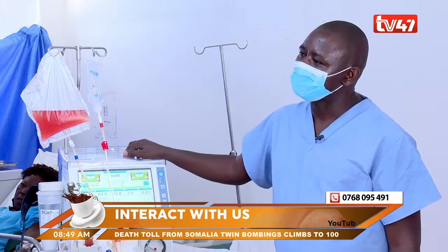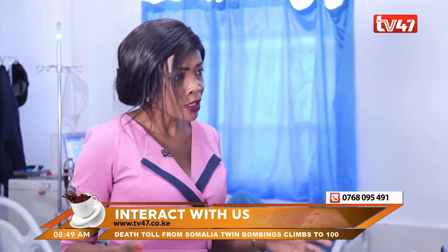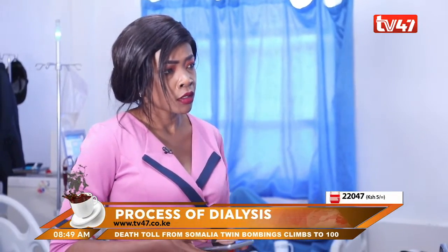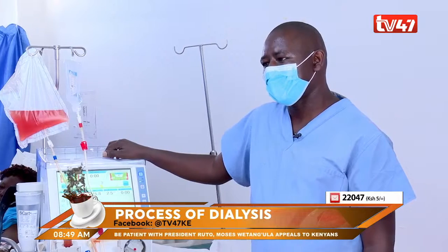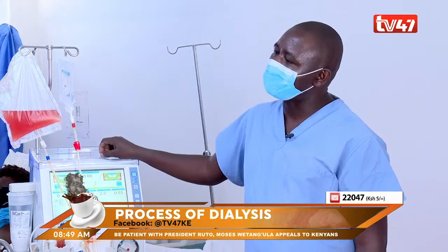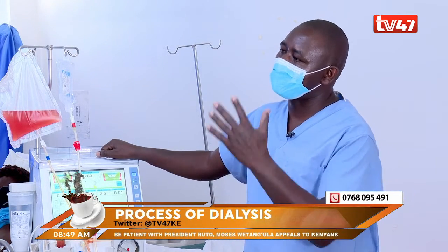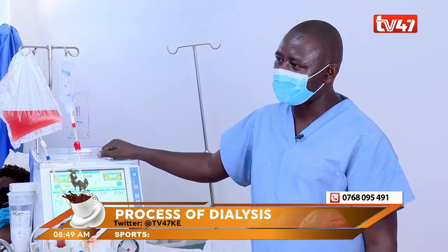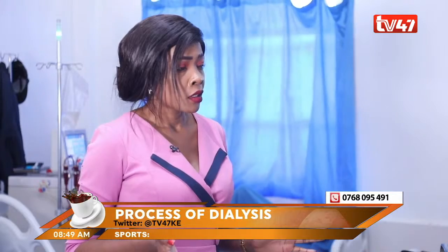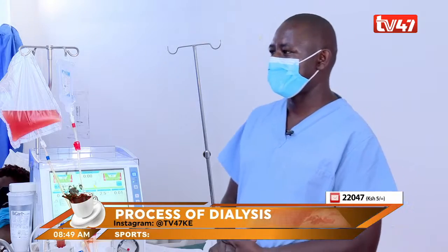You speak of different types of machines — does it mean there are different types of dialysis in terms of procedures? Majorly, this is normal dialysis. But we have a dialysis done for very sick patients who are in ICU — you can do dialysis even for 12 hours. This is called slow dialysis. These patients are unconscious and their blood pressures are not stable, so you do it slowly.